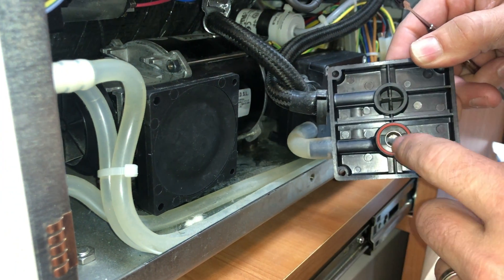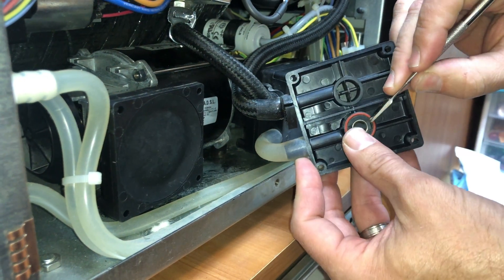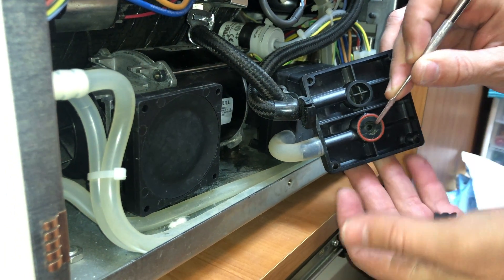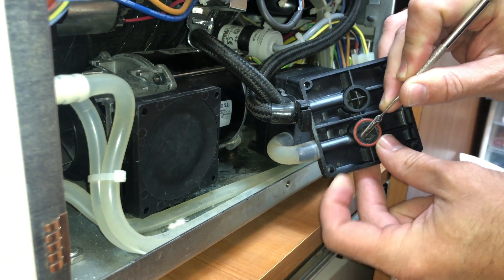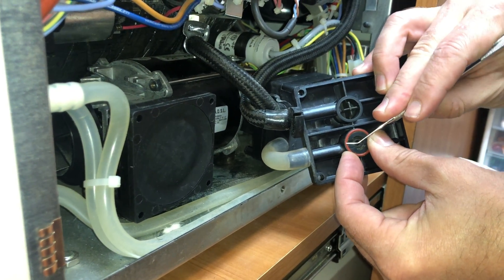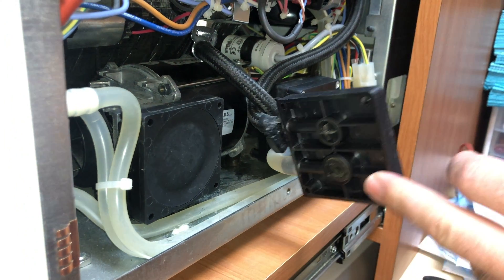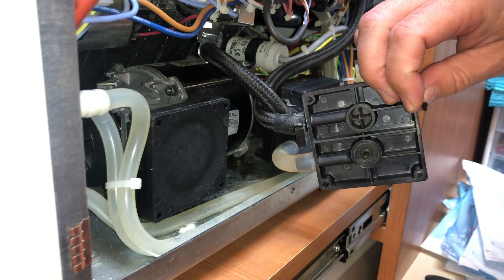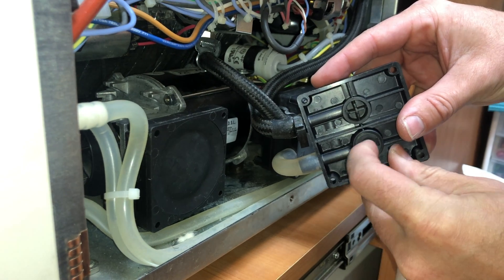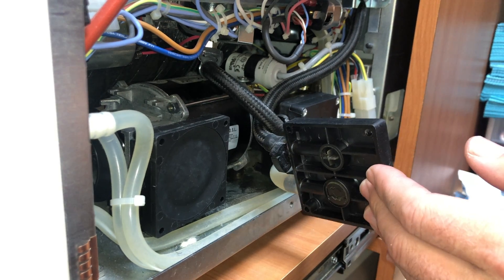Then you've got to reassemble, but first you've got to put a new O-ring and then this little diaphragm in here. So you pop out this clip and then this little tiny membrane comes out and then the O-ring comes out — it's bad so we're going to replace it. So then you put your new membrane in — I don't know if it's called a membrane or not, but that's what we're putting in.